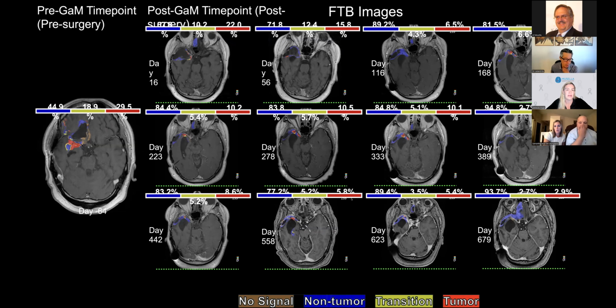Yes. So I'll back up and say that in 2020 there was a, well, I'll go back even further and say that there's a lot of different varieties of how you can perform DSC perfusion. In the literature, you could see that some groups were using some methods, and other groups would vary that up. And so there was this concern that how you perform it may alter your rCBV values.